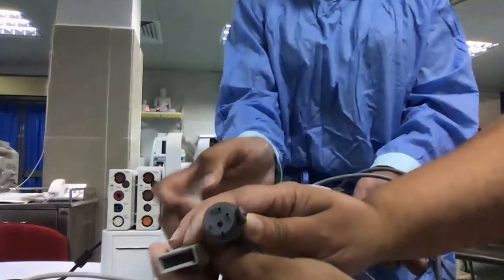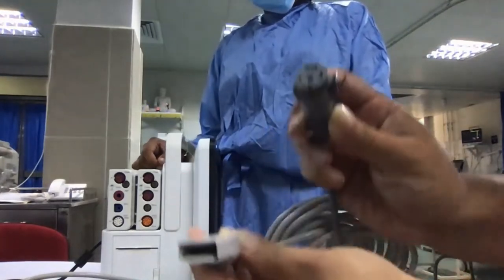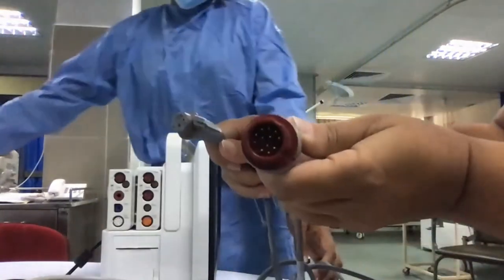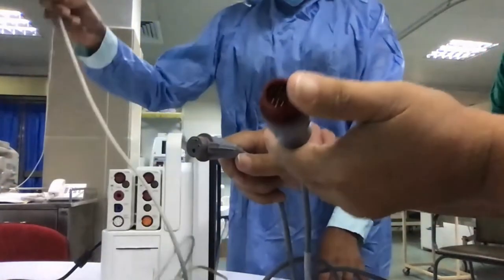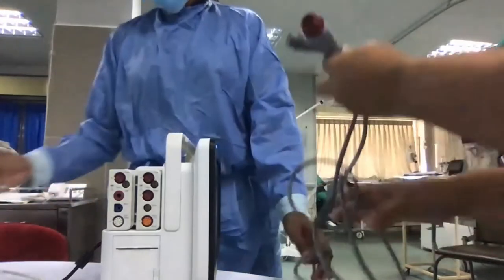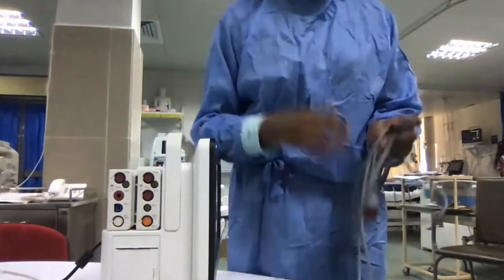So this is the end port, which goes to the transducer. Can everybody see here? These are the two types of end ports, but this is the one that is available for us in Peradeniya. The other end of it is quite similar to the MindRay inlet, which has pins, so it is compatible even with Fukuda, MindRay and Philips. So if you are short of wires, you can run to a Fukuda or a MindRay and grab one wire. Even though we don't recommend this, you can still go on.